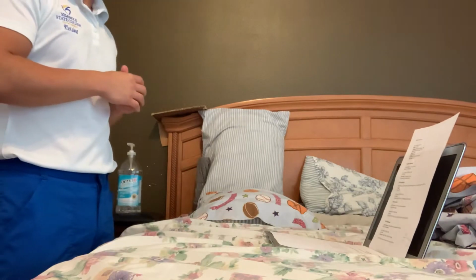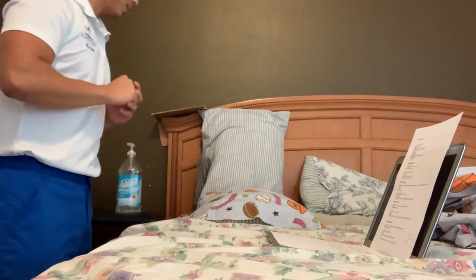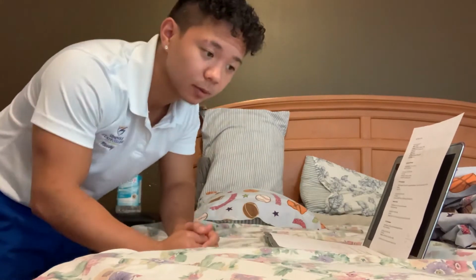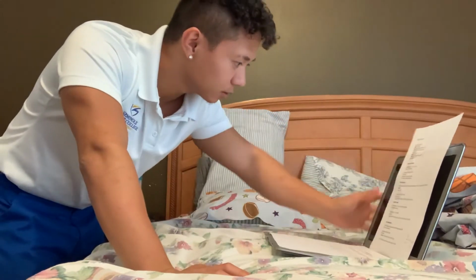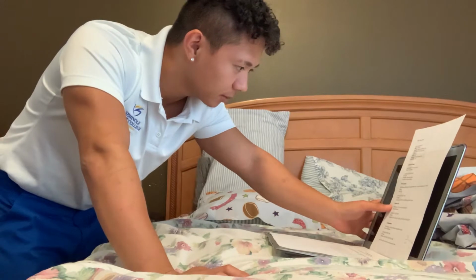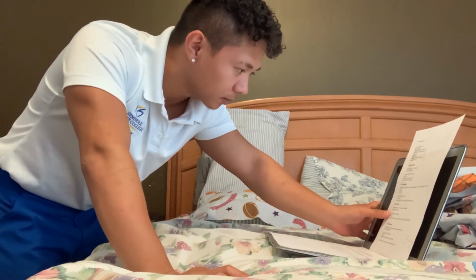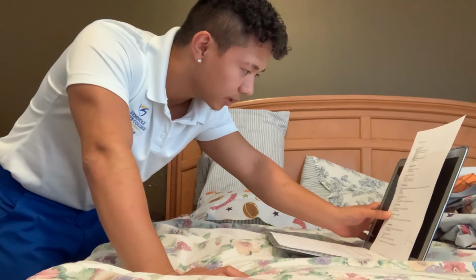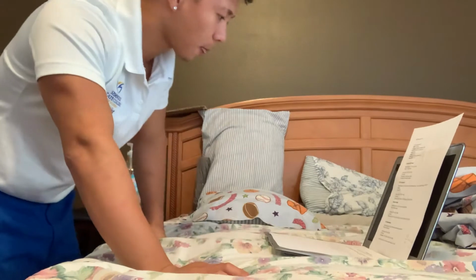And now I'm going to do my 6 rights for medication administration. So, right patient, Anna Pawlowski. Right drug, influenza vaccine. Right dose, 0.5 milliliters. Right route, intramuscular, right time at 14:58. And right documentation. I have the 6 rights verified.